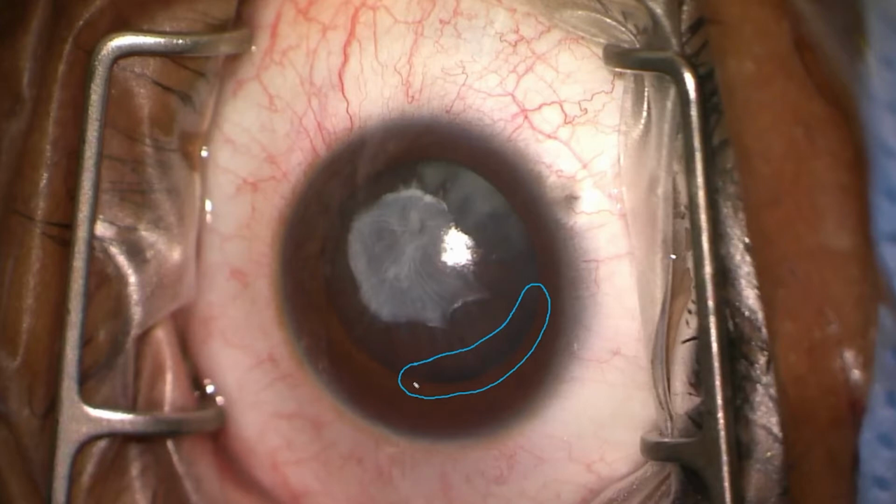And the problem that really is going on here is that the edge of the lens, or the equator, is way too visible. So the equator generally should be out here someplace so you cannot see it, but on this case, it's right there. And so that should ring some worrisome bells in your brain as to whether or not the whole lens is somewhat dislocated this way. There's no guarantee that it is. In fact, the other part that's going on in my brain as I watch this is whether or not the zonules out here are just on stretch, but aren't frankly fractured. But at the beginning of the case, you simply don't know that.